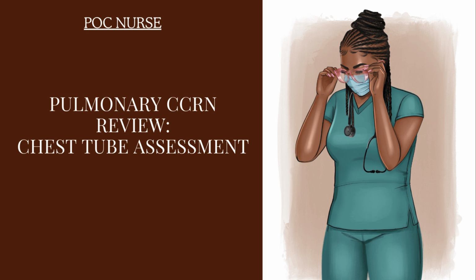if you have a dry seal drainage box, there will be a pressure gauge on it. Whatever you set the pressure to on the pressure gauge is the amount of suction pressure that will be happening in the box. If you have a wet seal drainage box, the amount of water that you have in the suction chamber is what will determine the amount of suction that's happening in the box. I hope that makes sense.